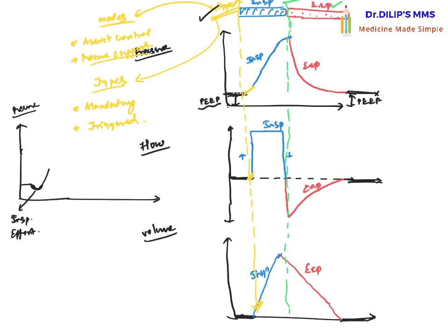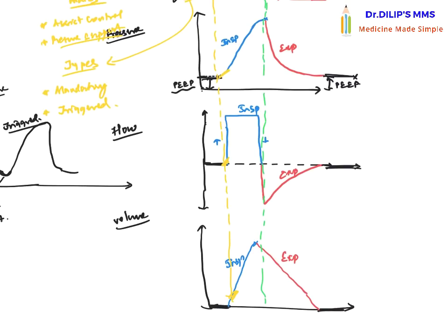If this inspiratory effort triggers a breath, this is what we are going to call a triggered breath. So an inspiratory effort of the patient is triggering the breath. This is a triggered breath.